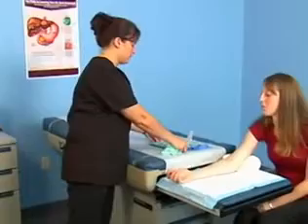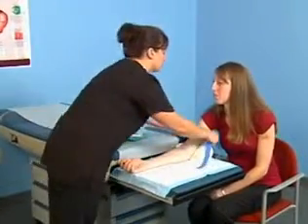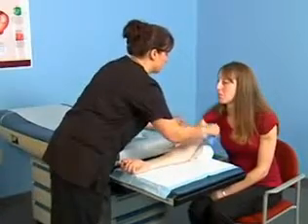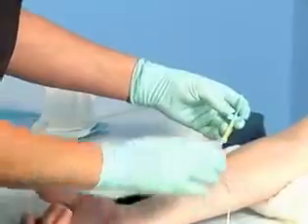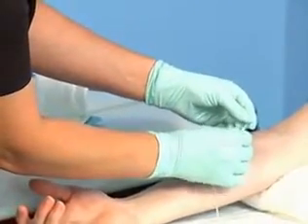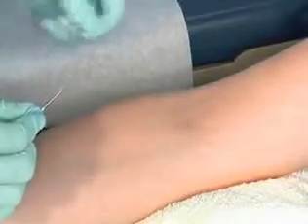Place your supplies within comfortable reach. Reapply the tourniquet and put on your gloves while the site is drying. Pick up the winged infusion set with your dominant hand. Press the butterfly tips together. Remove the protective sheath from the needle of the infusion set.